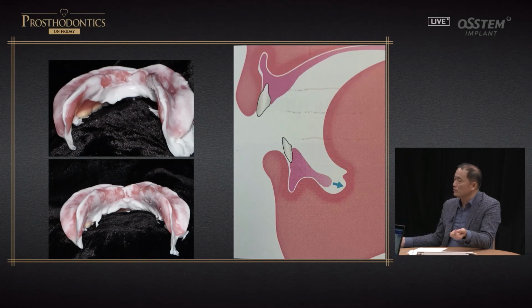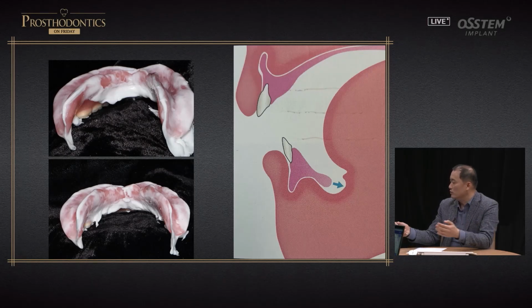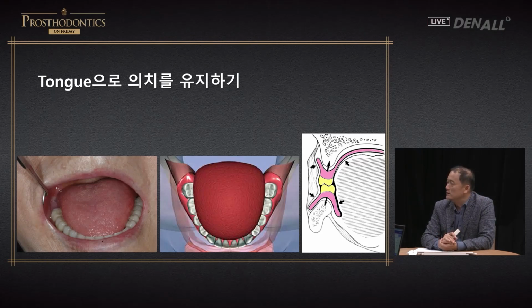So if there's a less lingual fold and the tongue is retracting, then sealing breaks. Even then, with border molding and other things, you need to be cautious and exert efforts to correct the situations. Next, with the tongue, you can maintain the denture in the position.